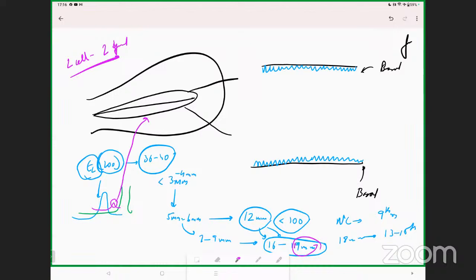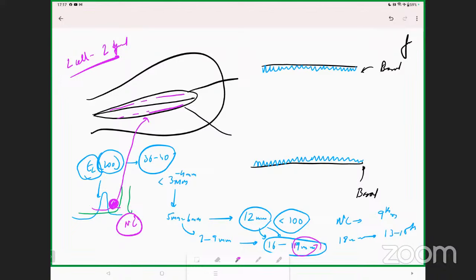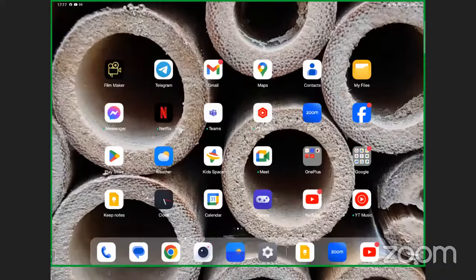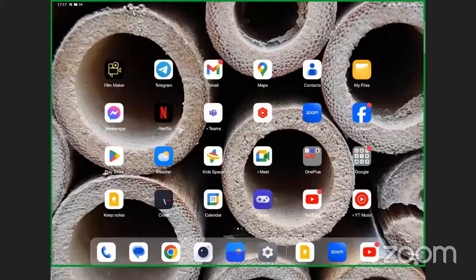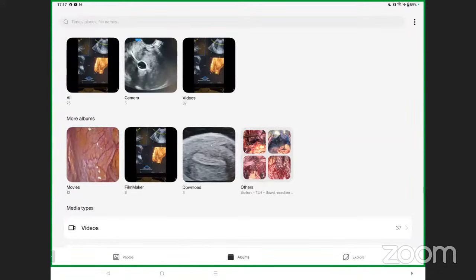This peak of progesterone causes the beginning of secretory changes to occur inside the endometrium, occurring at around the 19-millimeter follicle size, slightly before the LH surge. As a result, when you see an endometrium which is just about to become slightly hazy, you should suspect that progesterone has risen. From there on, the endometrium starts getting secretory changes in a natural cycle. Now I will switch to a simple video on the actual method of performing this technique.